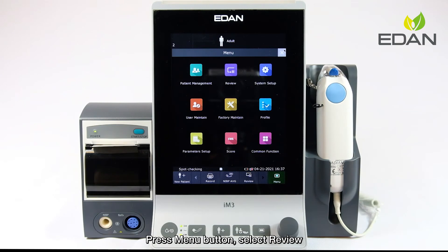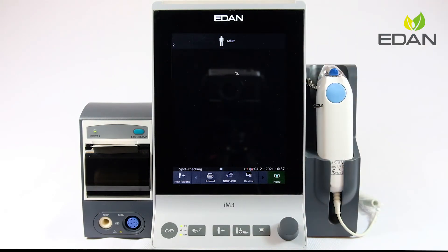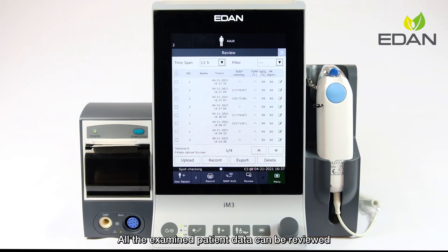Press the menu button and select Review. All the examined patient data can be reviewed. Click the icon on the right for more details.